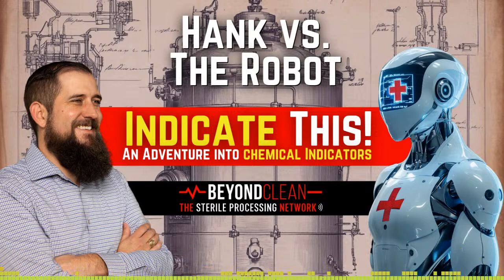Fight the bite. I don't know if I've ever heard that, Simon, but oh well, we'll run with it here. So you mentioned in a previous answer too, the potential challenges around color change. I'm curious to get your perspective and opinion on why some of these do use that color change as the mode of interpretation. There are some indicators and integrators out there that will use kind of a moving ink line, and then it's clear if it has passed the pass or fail line as it gradually increases across the indicator. What are your thoughts on that? Is there a better way, or should we be moving away from color change into more of an objective type reading for these tests?